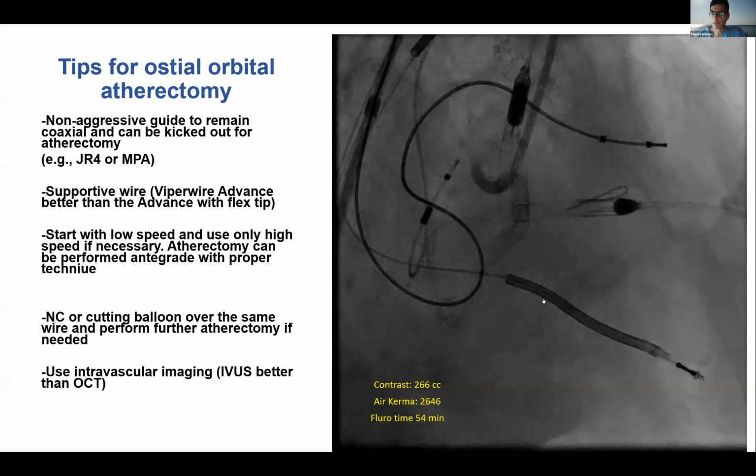So here's another question that just came up about the restenosis rates. Given the high restenosis rate with covered stents, other than clinical assessment, are you following them up with any repeat angiogram or any other imaging? So curious, what do you do in Mass General and Henry Ford?